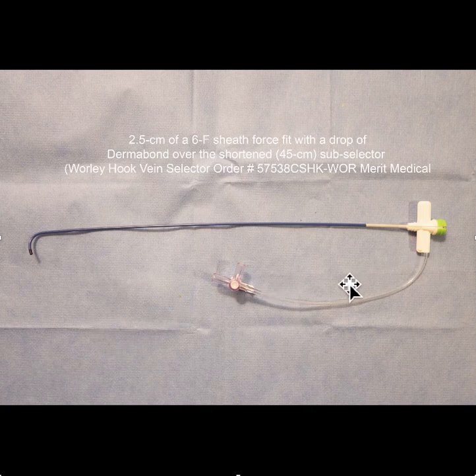In any event, that would give you some different options to play around with. You could move this in and out of the Worley sheath — the shortened Worley sheath — and give you better control in the area of the HIS.